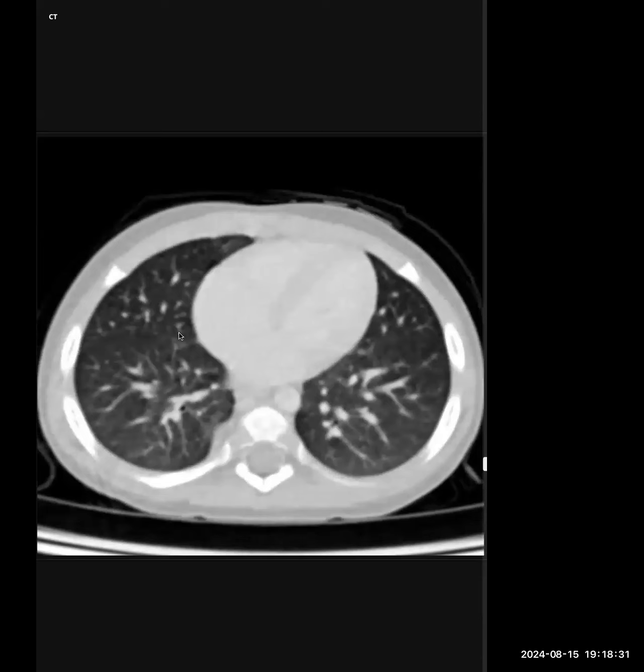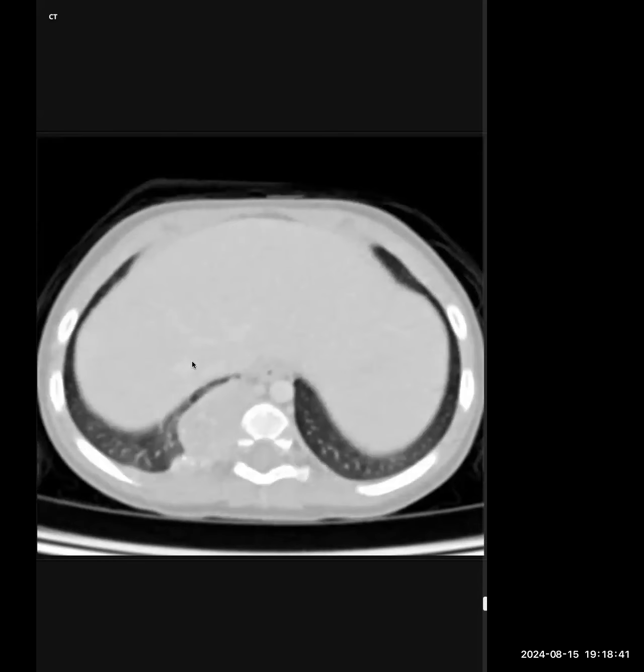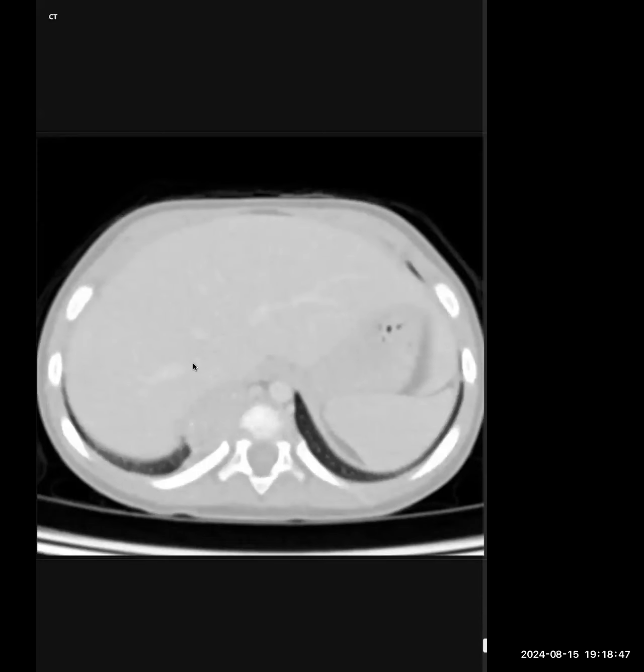Okay. And then if they tell you that, because this is an opportunity, if they think there is not much to be added from the mediastinal window, they will ask why you are asking for it. And then you say, oh, this is why, and they'll tell you this patient did not have a neural extension, or this patient did not have a rib involvement. And now you know you don't have to go through an entire new sequence to get that little bit of information, which ultimately is not adding to your diagnosis, right? So yeah, you can save time that way.